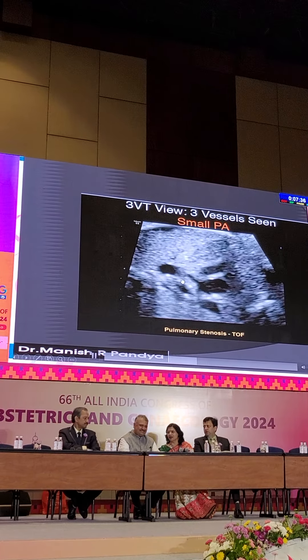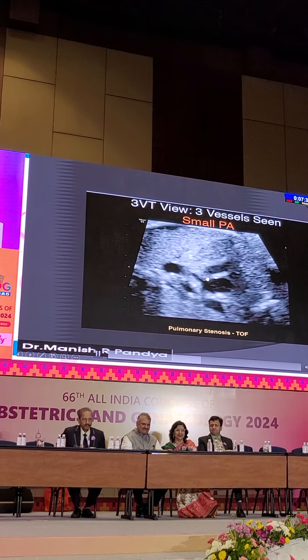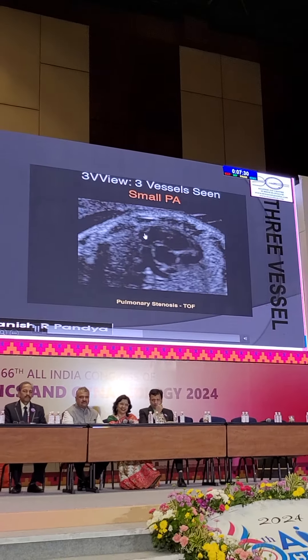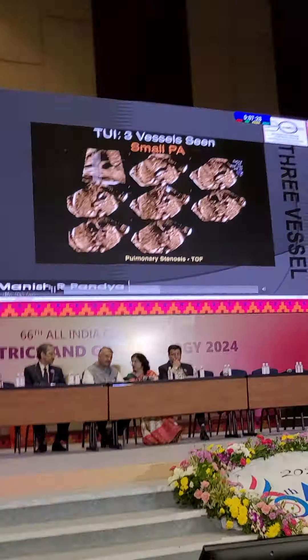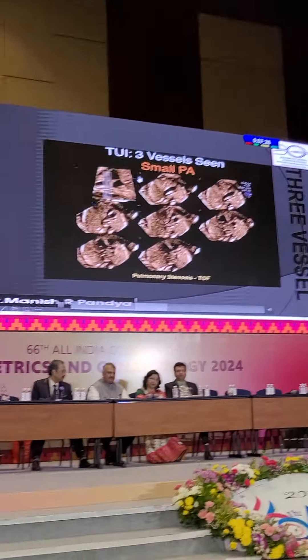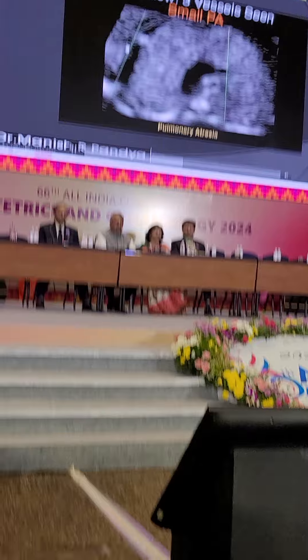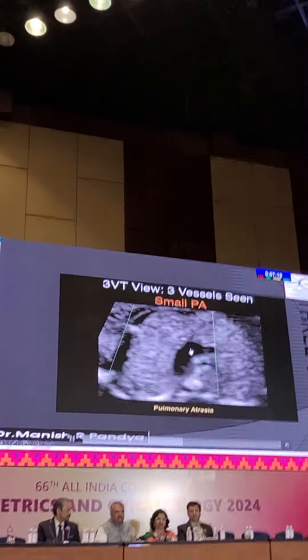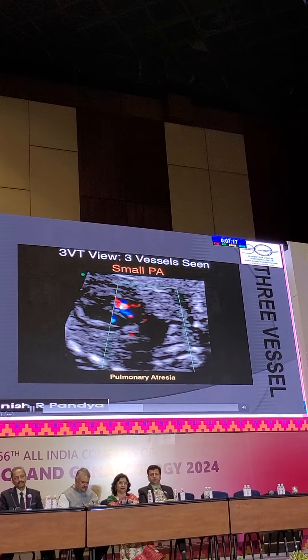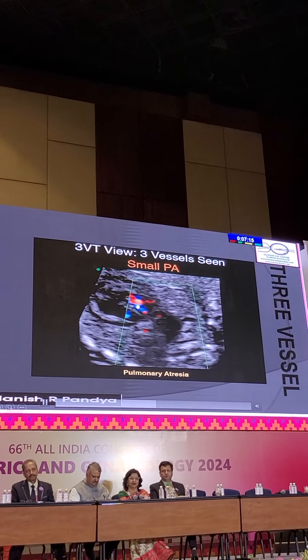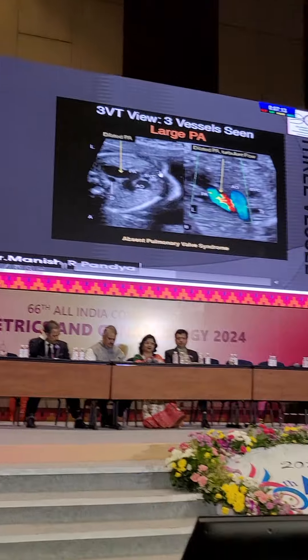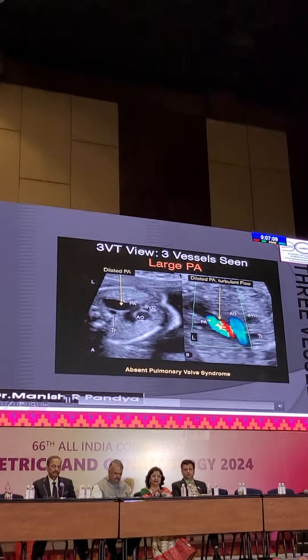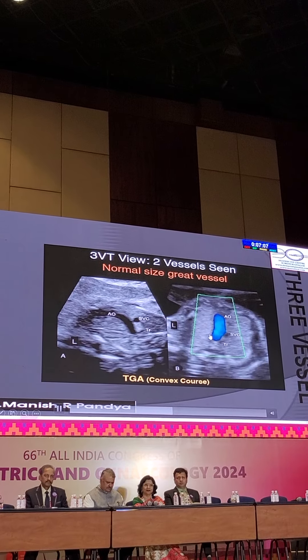You can see pulmonary stenosis in tetralogy of Fallot. Typical pulmonary stenosis is seen in the three-vessel tracheal view — you can see pulmonary stenosis with a small pulmonary artery. You can see all these things in TUI mode, and this is a very good advantage of some machines. Pulmonary atresia is very well seen with small pulmonary arteries. You can also have a dilated pulmonary artery with turbulent flow that is absent in the pulmonary valve.